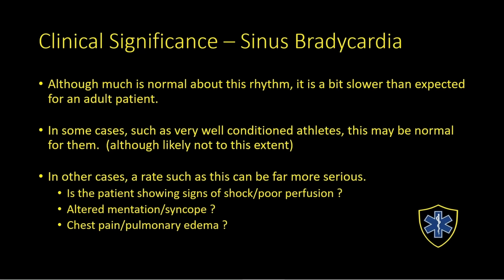So let's look at the patient condition. Some of the questions we want to ask ourselves in seeing this rhythm: is the patient showing a sign of shock or poor perfusion? Are they having altered mental status or syncope? Are they not perfusing their brain adequately? Are they experiencing chest pain? Are they experiencing signs of heart failure, such as pulmonary edema? If none of this is true, the patient's got no signs of shock or poor perfusion.